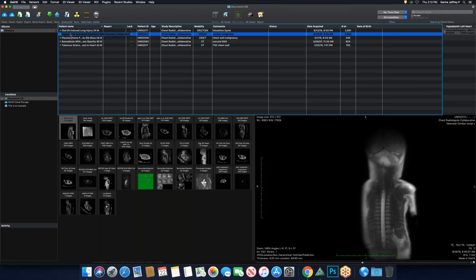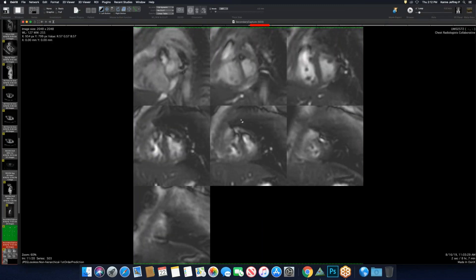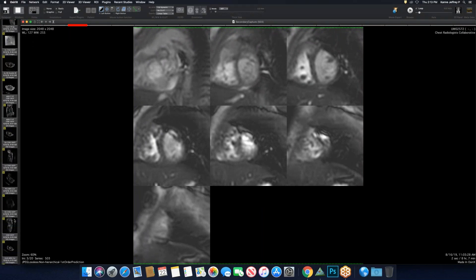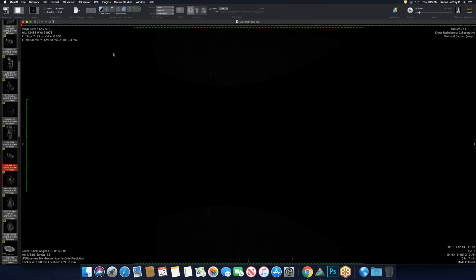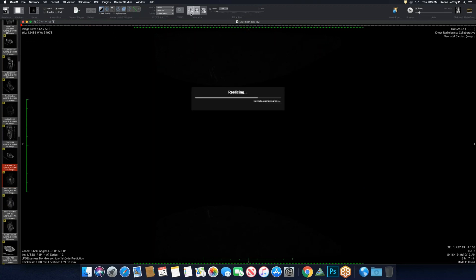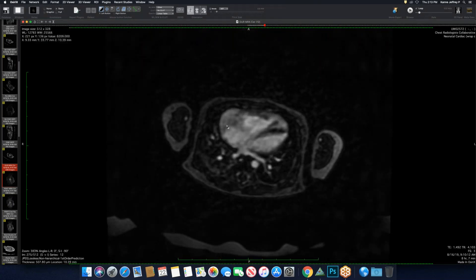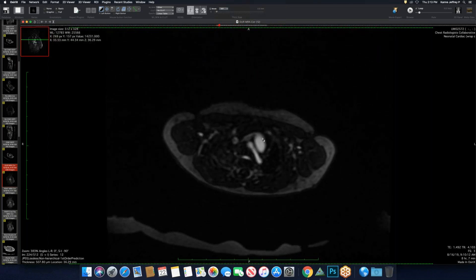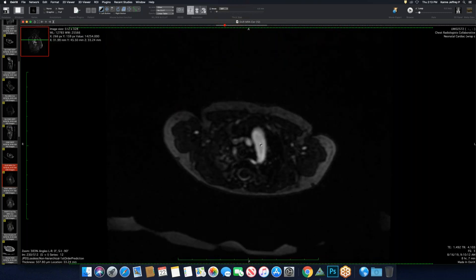The last case is a cool one — Seth and Travis will particularly like this. This is a two-day-old female born with hypoplastic left heart syndrome. I'm pulling up the MR angio — the arterial phase — reformatted into the axial plane. We can see the small left ventricle, the large right heart chambers. There's the pulmonary artery with branch pulmonary arteries, and then a large communication here with the descending aorta — a large patent ductus. There's a hypoplastic aortic arch with branch vessels and an aberrant subclavian. There's also a little funny communication right here between the aorta and the pulmonary artery right where the sinuses of Valsalva is — a little coronary fistula.